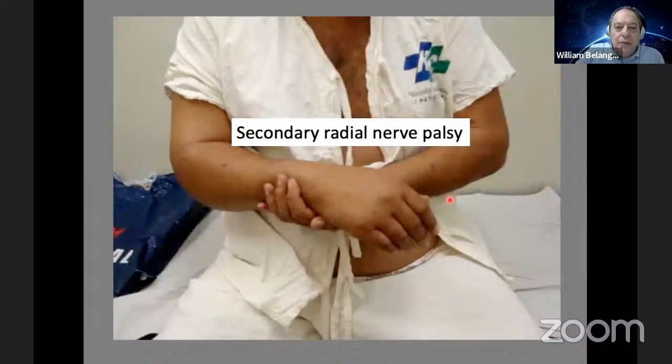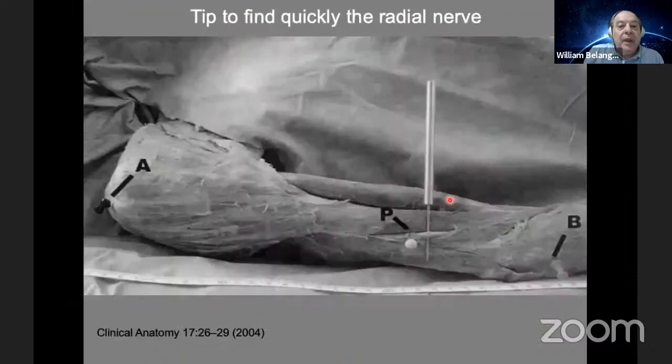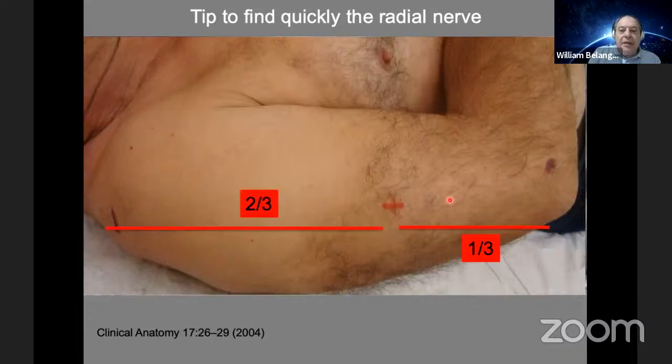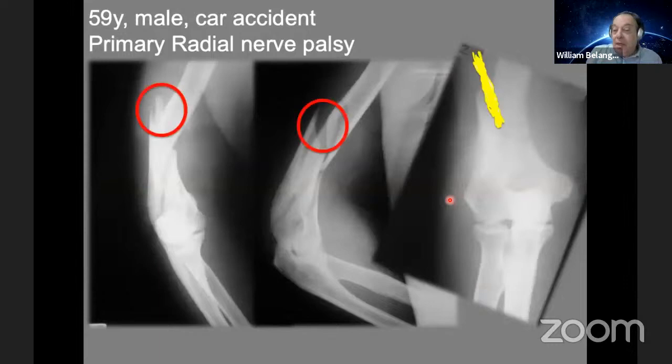Before surgery, we use ultrasound to look for the radial nerve. And in this case, we saw that the radial nerve was not well defined by the ultrasound examination. And this is a very important sign that maybe the radial nerve was damaged, was inside the bone fracture. Okay, this is a tip to find quickly the radial nerve between the brachialis and brachioradialis. The radial nerve is here. You can divide the length of the arm in 2/3 and 1/3, and at 1/3 you can find here the radial nerve. Well, that's our hypothesis.